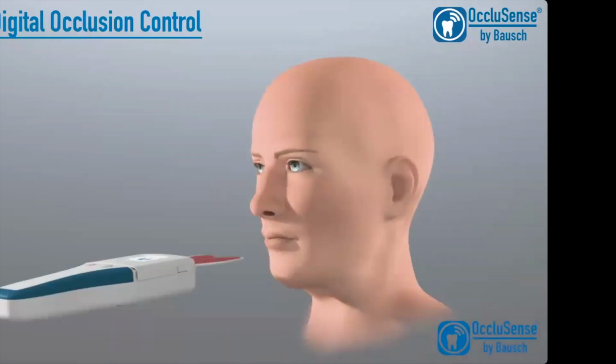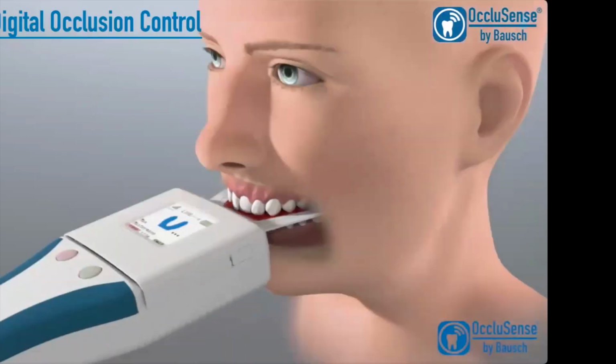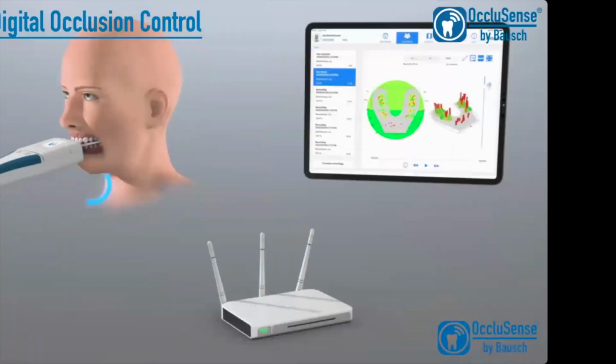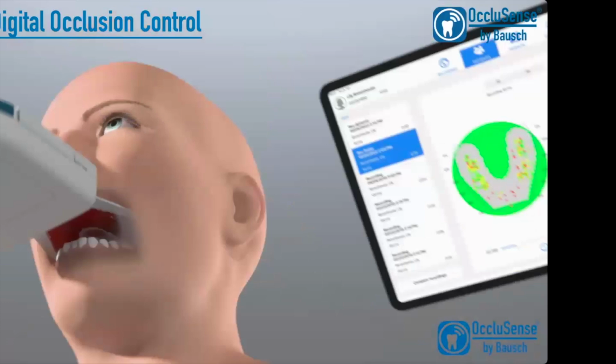So you insert the sensor into your patient's mouth, get them to conduct any movement that you want to have recorded, and the data will then be wirelessly transferred onto an iPad where the illustration is then shown.